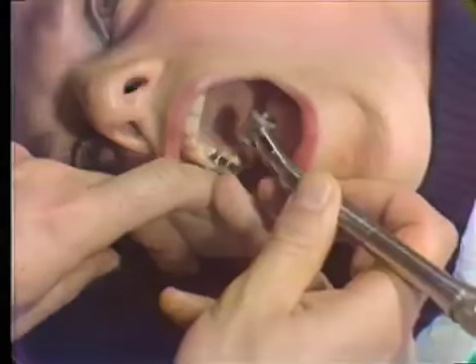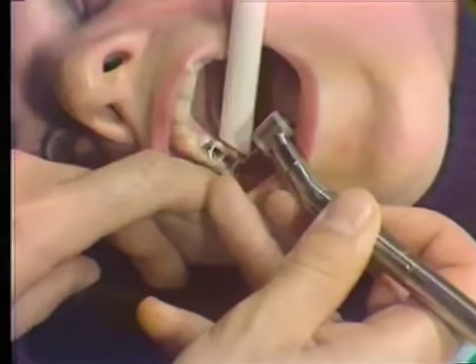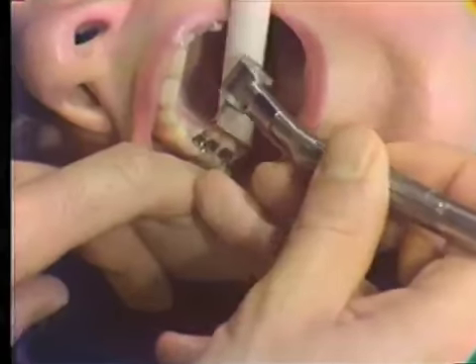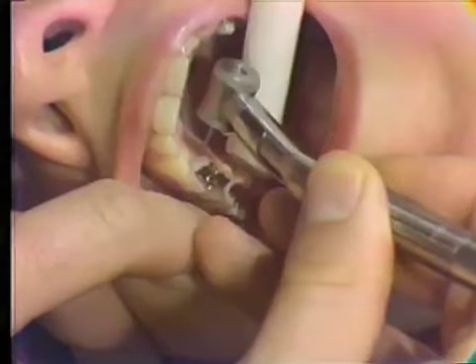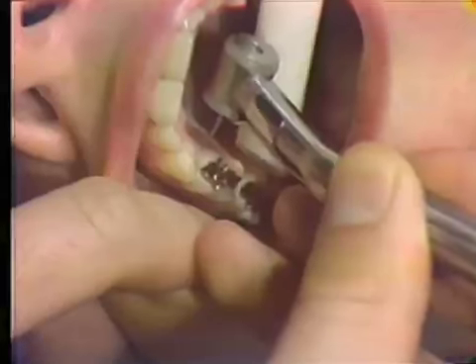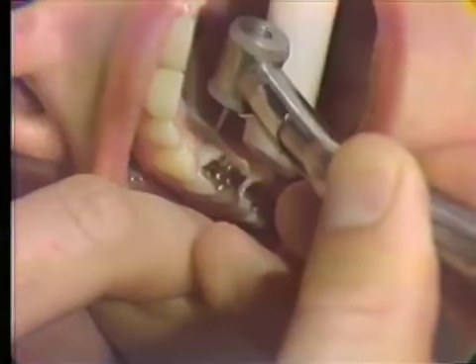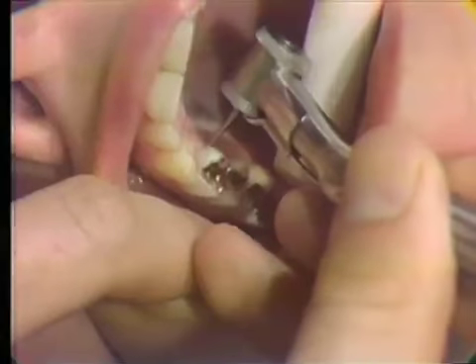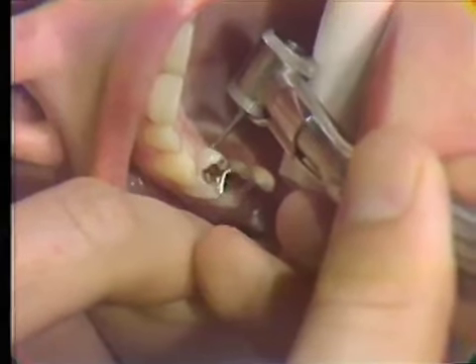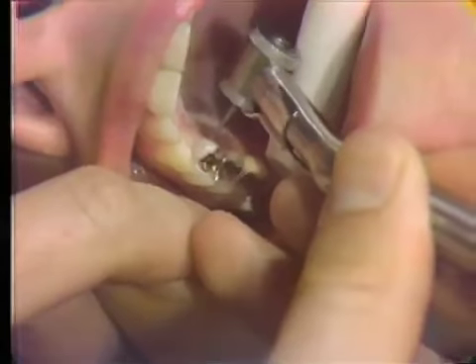The evacuator tip is placed along the lingual surface 1 to 2 teeth distal of the tooth being prepared. In the most posterior teeth, intermittent evacuation is recommended as fluid accumulates. Although the right posterior segment is somewhat less accessible than the other two maxillary segments, the supine patient position still provides a relatively comfortable approach to treating this area of the oral cavity.